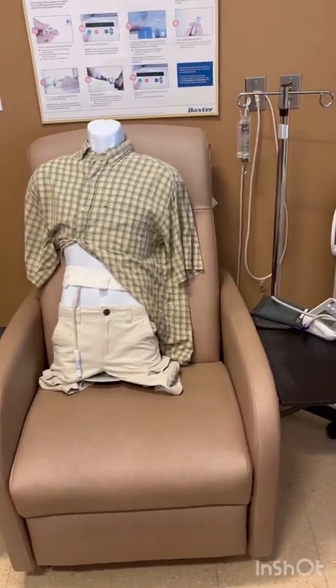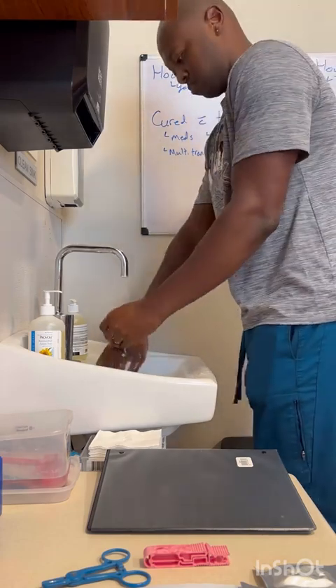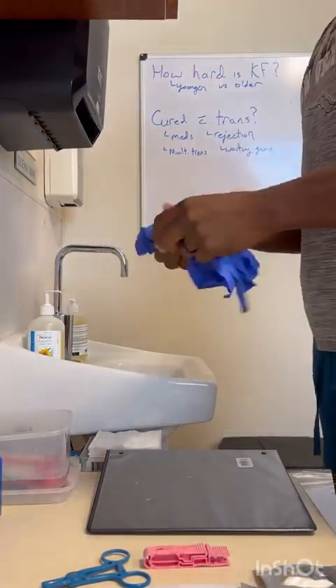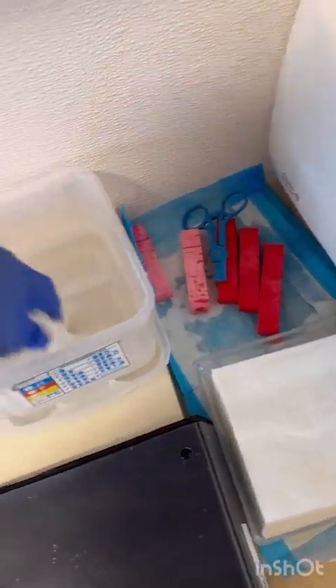This is Steve and we're going to do a manual exchange together. First thing I do is wash my hands for 20 seconds — just saying happy birthday to myself — then dry my hands, put on some gloves, and clean off my workstation.